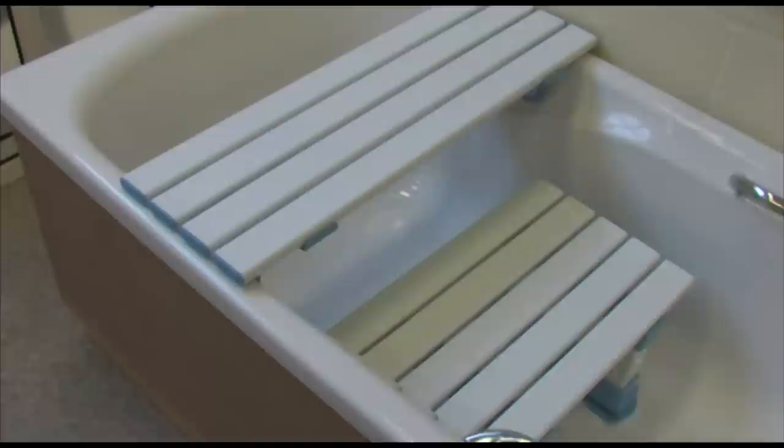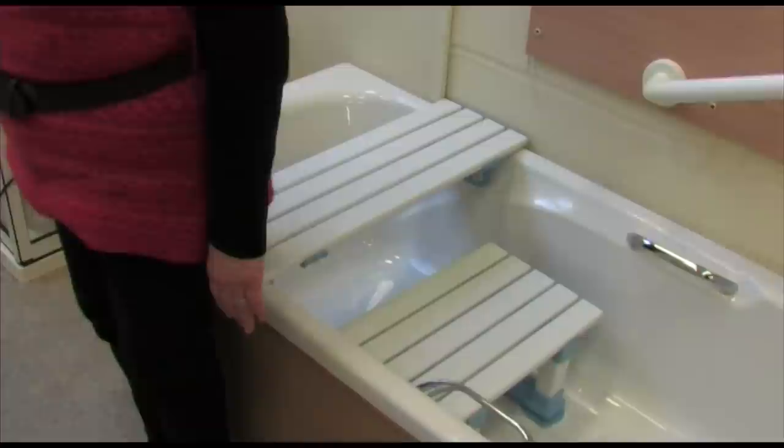If you have difficulty getting down into the bath, a bath board and seat will enable you to use the bath more safely. If you prefer to shower, a bath board can be used on its own. In this short tutorial we'll show you how to use these pieces of equipment.